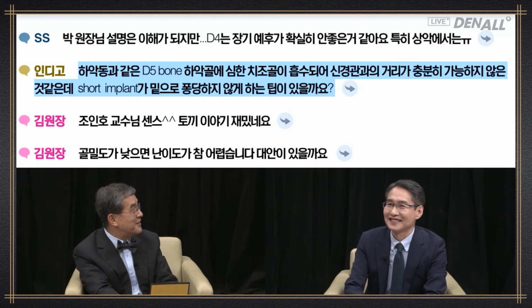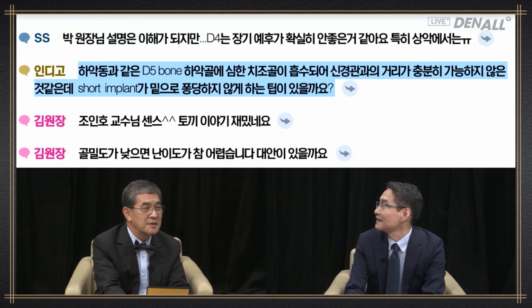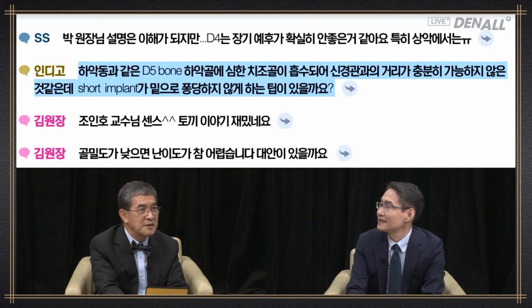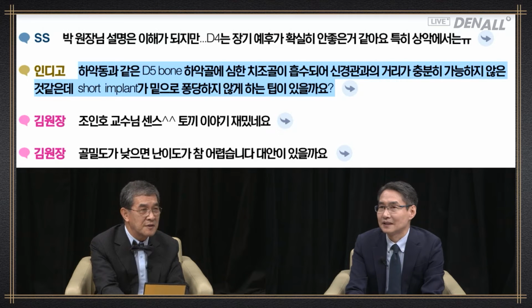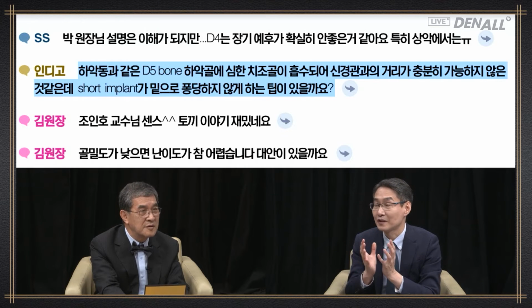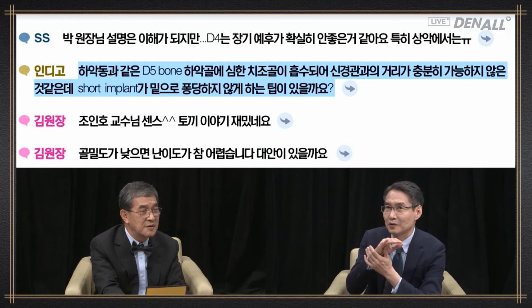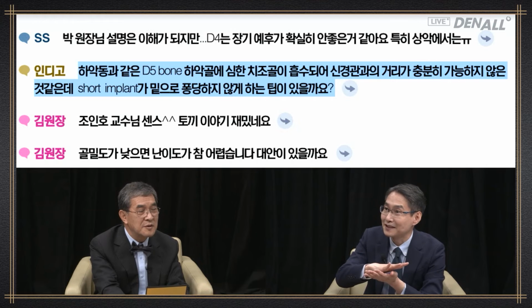I'm a prosthodontist and I don't believe it's my place to talk about surgery. However, let me give you my example. Initial drilling, you need to understand the bone quality, that is most important. Depending on that, you can do undersized drilling. And if there's only very thin cortical bone and there's a spongy bone or bone marrow below, when you place implant on cortical bone, once the implant penetrates the cortical bone, at times you make a mistake and it falls in. I'm no exception.